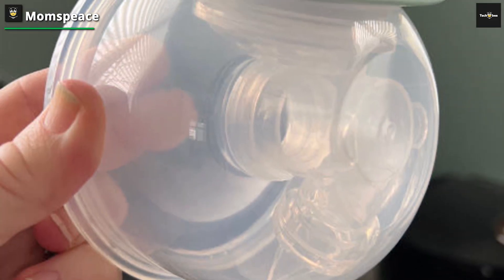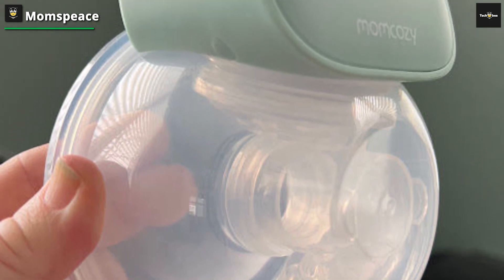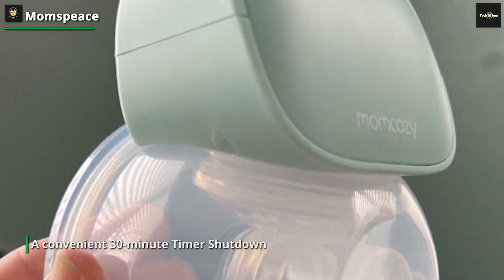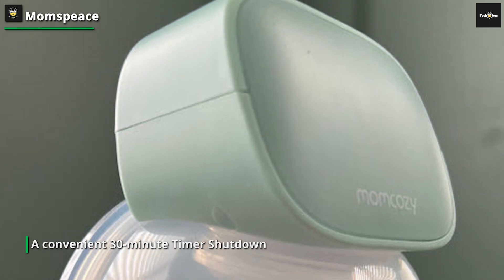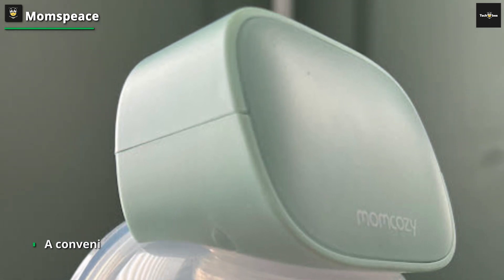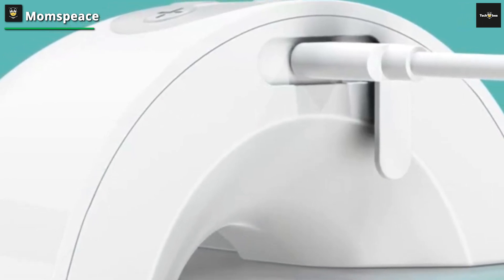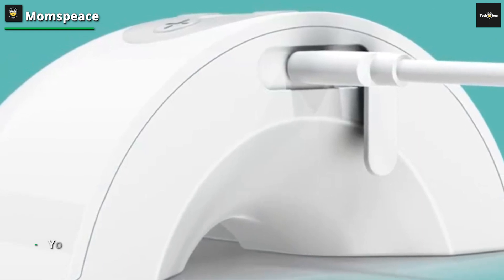This intuitive feature enables mothers to effortlessly track pumping sessions. Tailored to align with your lifestyle, our wireless, potent, and inconspicuous breast pump permits you to engage in diverse activities — from playing with your toddler and working to grocery shopping and doing laundry — all while effortlessly pumping, and a memory function that recalls the last settings used.